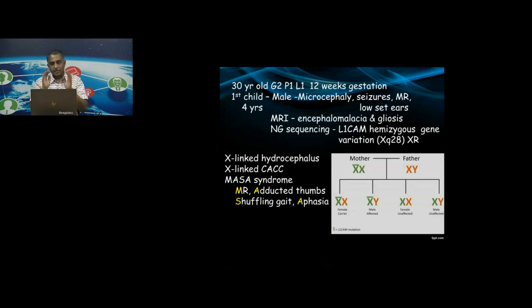And this is extremely important because a lot of times the index child workup becomes the starting point. Here is a case example where it's 12 weeks. I have not found anything really spectacular in terms of pathology by imaging, but I know from history that yes, this couple has already had an X-linked recessive disorder in terms of an L1CAM gene problem which has affected the child.